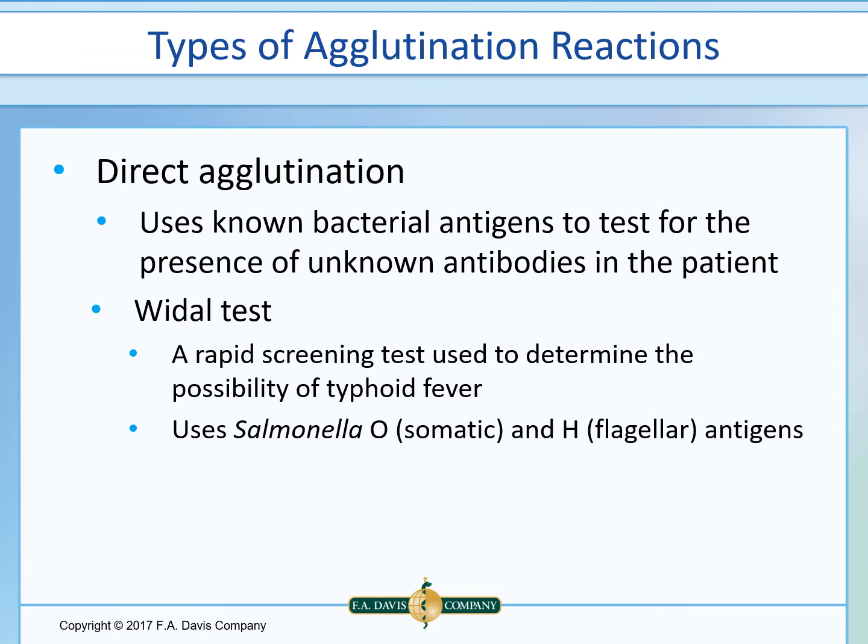Typically, most agglutination tests are qualitative, in which they indicate only the absence or presence of antigen or antibody. But there are scenarios where dilutions can be made to obtain semi-quantitative results.